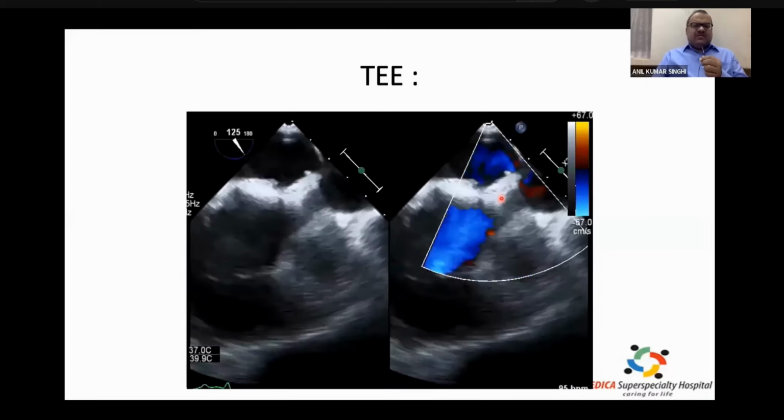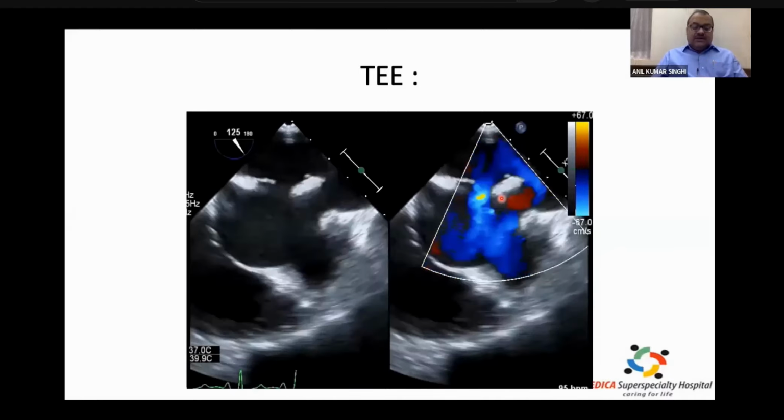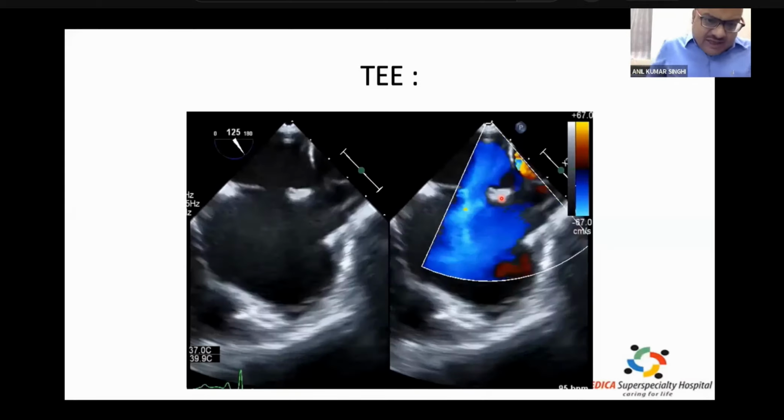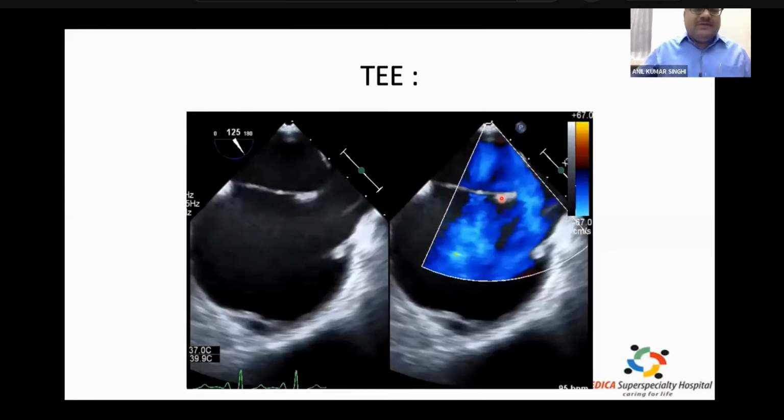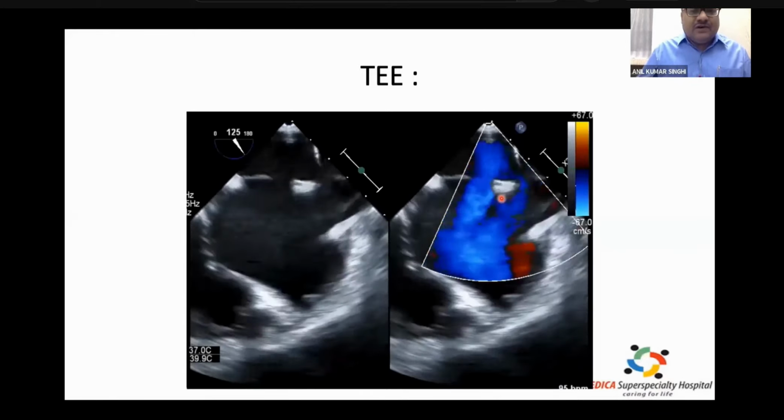And once we found an additional large secundum ASD ostium, sinus venosus ASD, the case is no longer favorable for any transcatheter regular intervention, though nowadays we are trying a little bit. So it was sent for surgery.